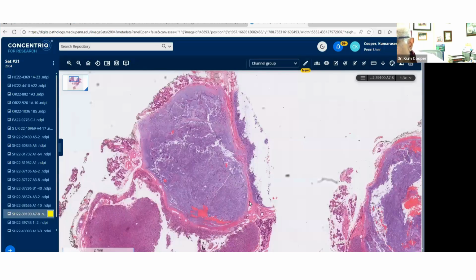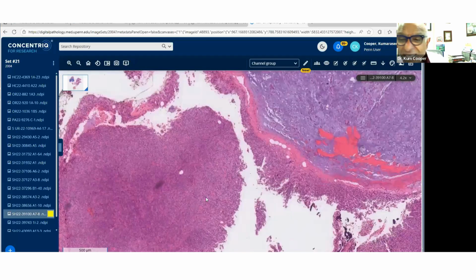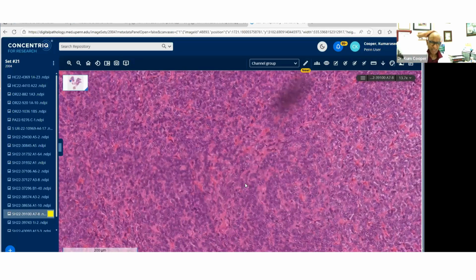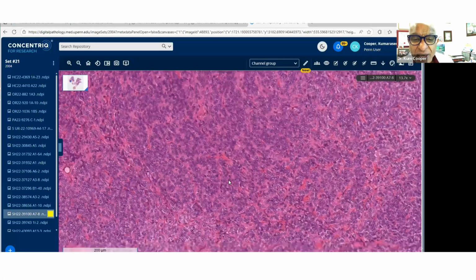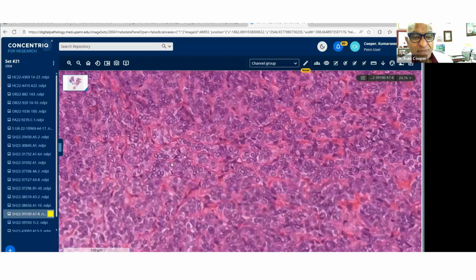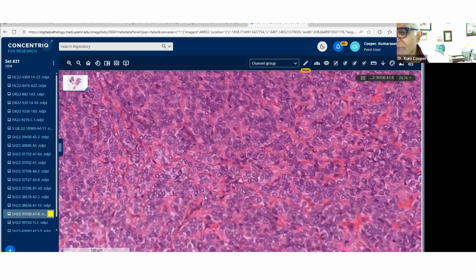Interesting question. Can this be clear cell carcinoma ex pleomorphic adenoma? Well, that's a good question, Maria, because I didn't go into it, but this marked up as myoepithelial cells in the myxoid area. So it clearly had the S100, the myo, and the epithelial components positive. Clear cell carcinoma can have P63, can have glycogen. Of course, you'd need the fusion to confirm it if you have that as well. And it does have a hyalinized pattern. I know you went for this pattern here and asked the question, could this be a clear cell hyalinizing carcinoma? But this does have the markers of myoepithelial differentiation, so that helps with that.